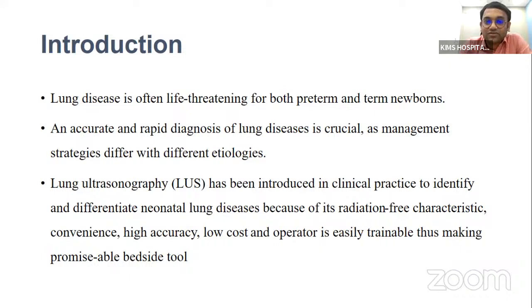The advantage with lung ultrasonography is that it is radiation free and very convenient to use. It has high accuracy and is very low cost. In fact, we don't need any other accessories except the ultrasound machine and the probes. And it is very easy to operate if we are adequately trained. So in this way, it is a very promising bedside tool for the assessment of lung status and the identification of pathologies.